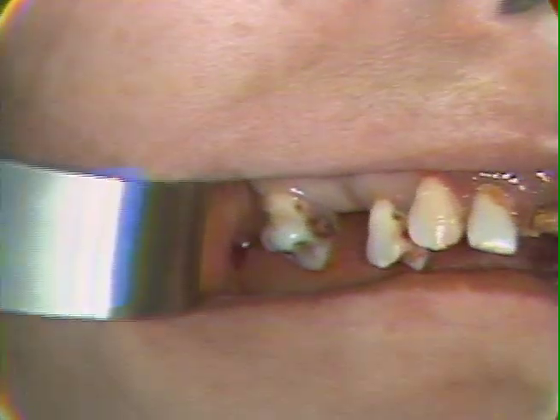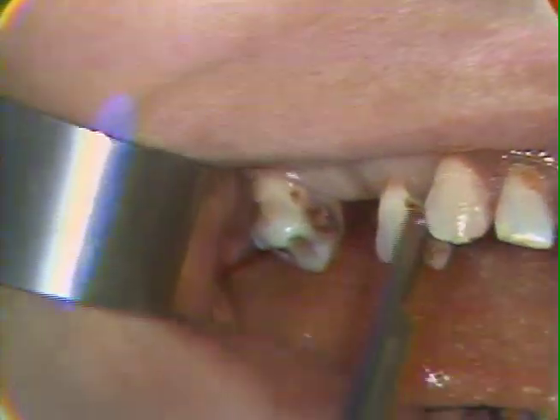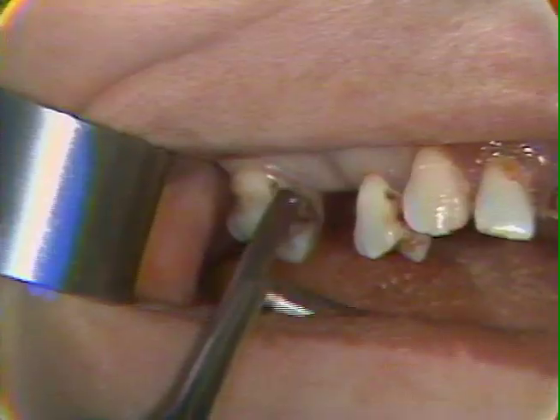The well-supported bicuspid we will be removing perhaps first, as well as the cuspid, and we'll carry on with the removal of these widely spaced residual central roots that are so extensively involved, and then the teeth on the opposite side as well. So we will turn our attention first to the exposure and the flap reflection to gain access to this premolar and cuspid area.